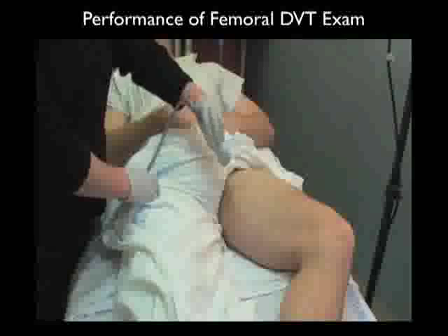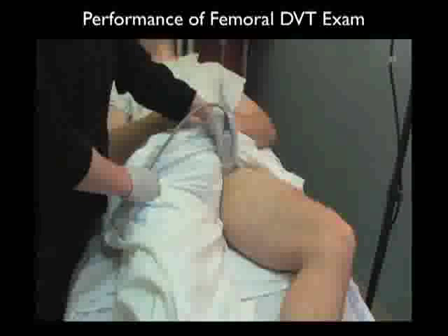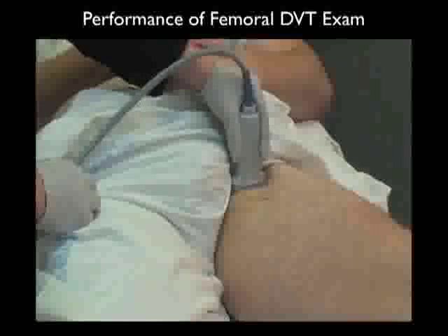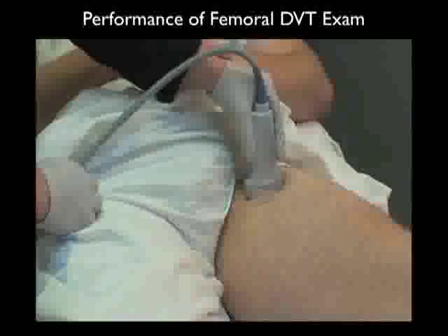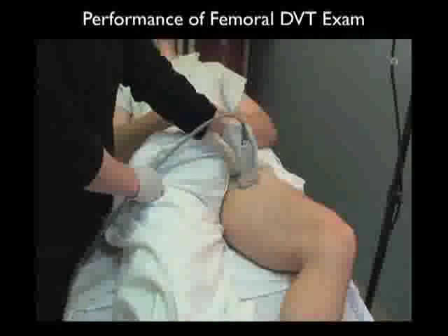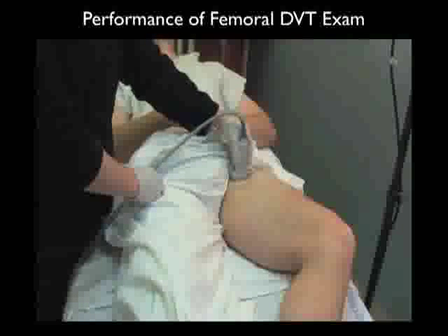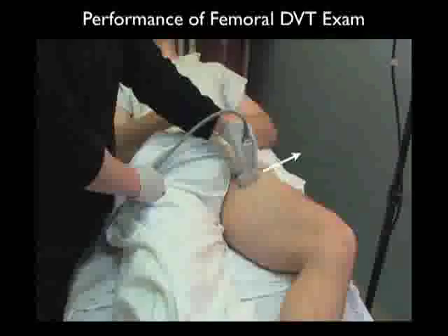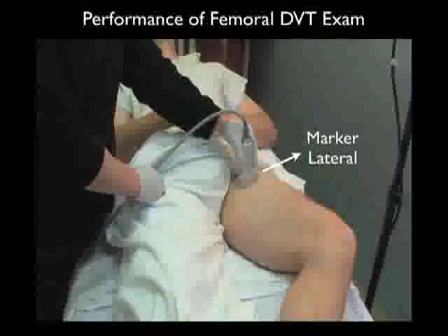Let's now watch a video and learn how to perform the ultrasound examination looking for a DVT within the femoral vein system. We begin by placing the high-frequency linear array probe in a side-to-side orientation over the common femoral vein and artery just below the inguinal ligament. Notice that we're compressing down with the probe — the DVT exam is essentially a compression exam, as a normal vein will completely close with probe pressure. We're sequentially compressing at different levels along the common femoral vein from just below the inguinal ligament all the way down through bifurcation into the superficial and deep femoral vessels. It's standard to have the marker on the probe going lateral to maintain orientation.